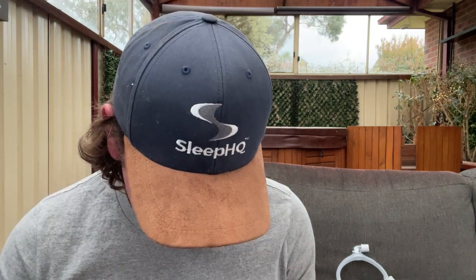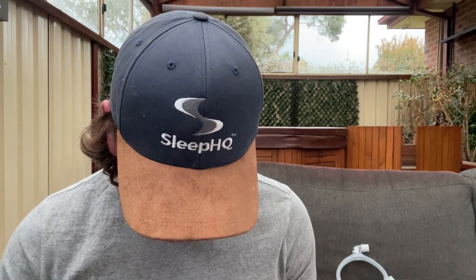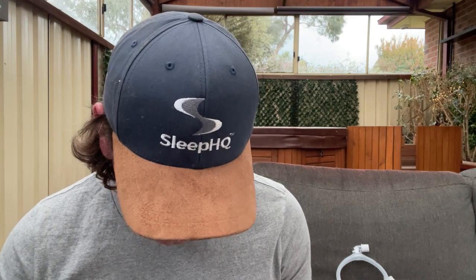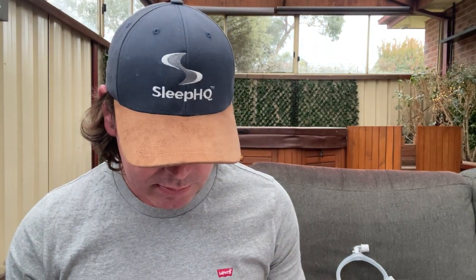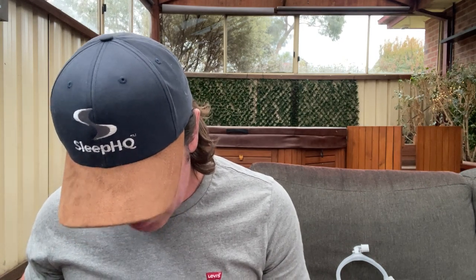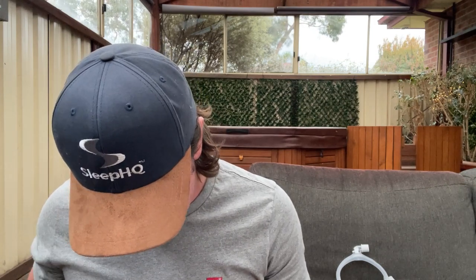So this is the original Philips manual, the non-updated one, and I'll read you a little bit about what they say here. Where's this? No wonder no one can find the thing. It was here a minute ago. I've lost my mind. Do not use bleach or alcohol, blah, blah, blah. Where's the mystery page? All right, so here it is.